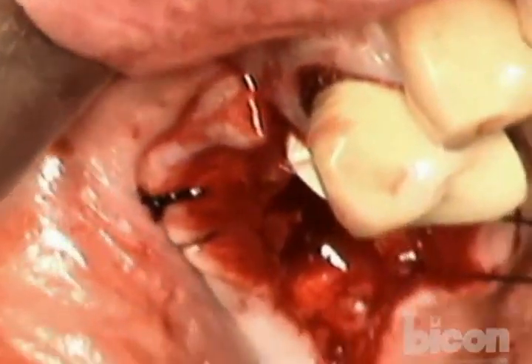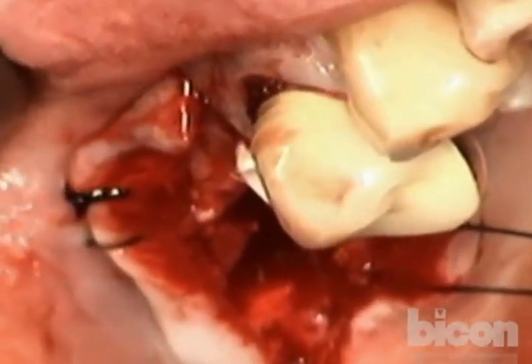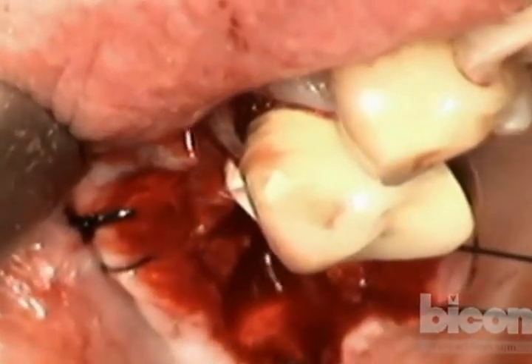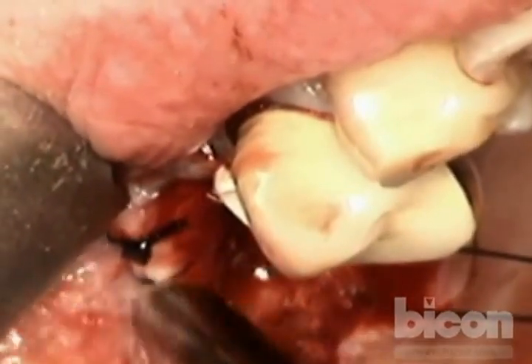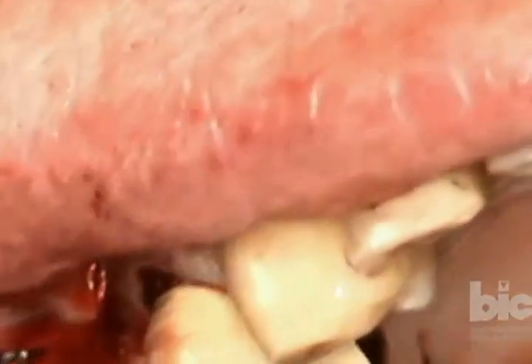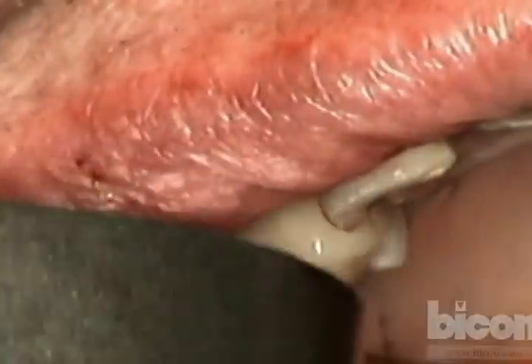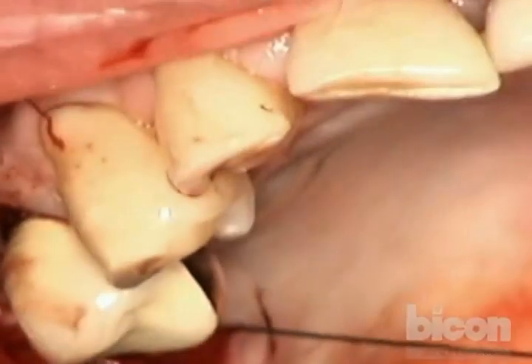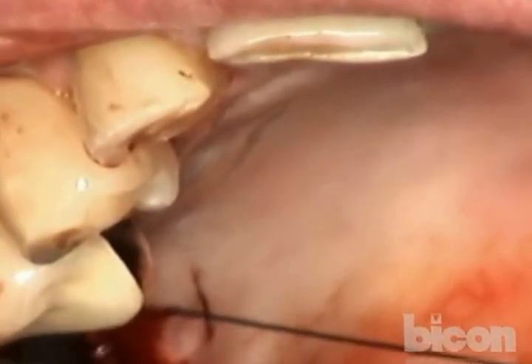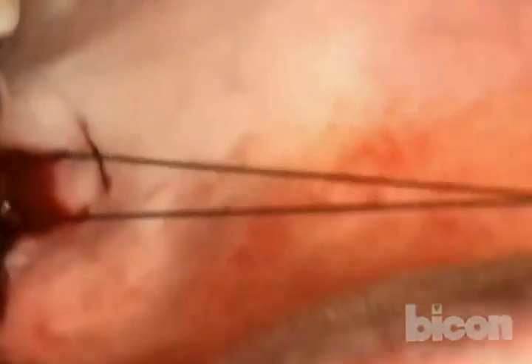As you see now, the key to the technique is that the sides of the sinus or the sides of the alveolar crest are narrow enough so that they would exert friction and pressure on the palatal and buccal of the implants. That way, although we don't have mesial and distal contact sometimes, and certainly no dense and solid and immobile floor, we can still have primary stability of the implants. Open wider if you could. Thank you very much.